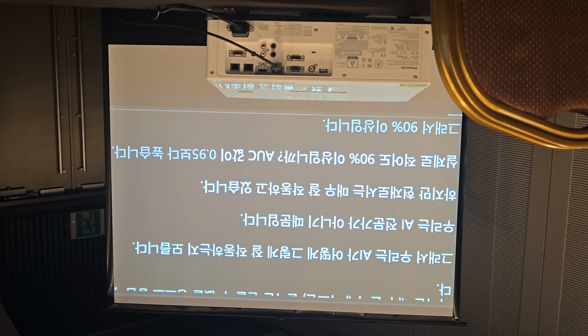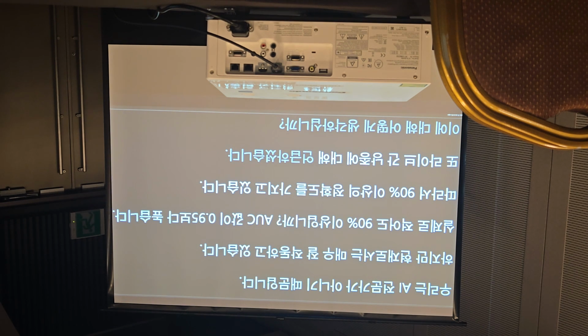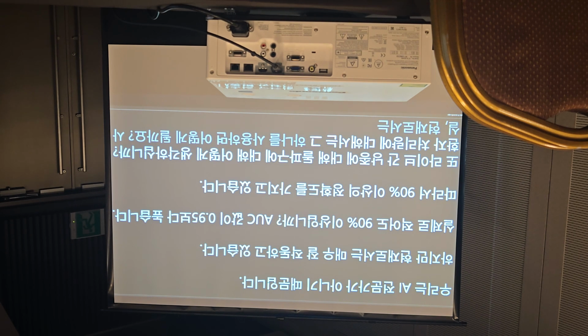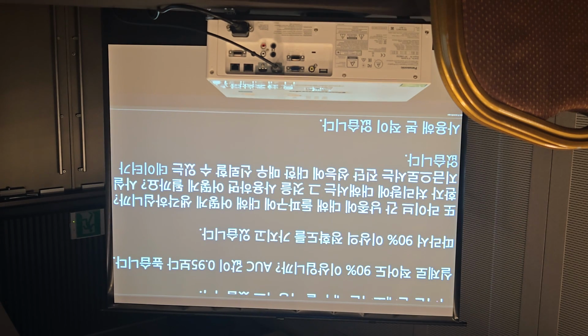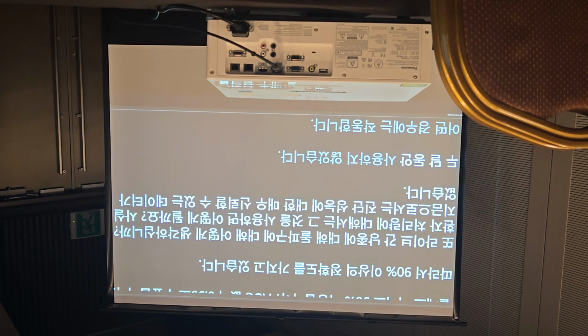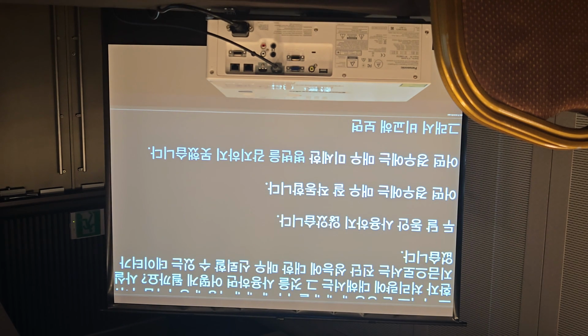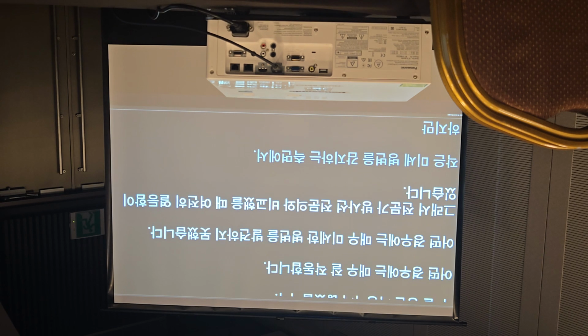Another thing is you mentioned the live liver assist. What is the breakthrough for the patient if you use that one? Actually, as of now, I don't have very reliable data regarding diagnostic performance. I have been using it for 2 months. In some cases, it works very well. In some cases, it couldn't detect very subtle lesions. So compared to expert radiologists, it still has inferiority in terms of detecting small subtle lesions. But for inexperienced users like a resident, it is definitely helpful.